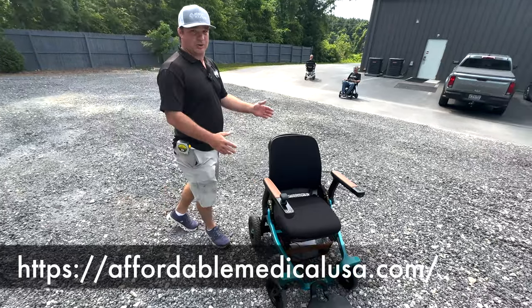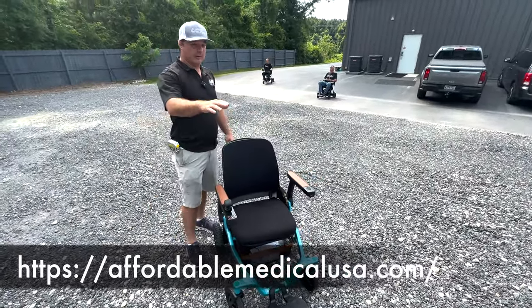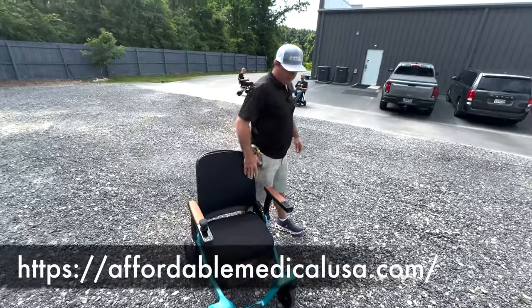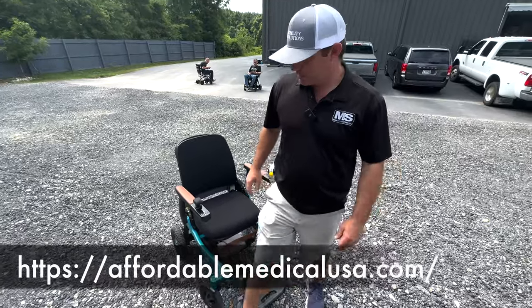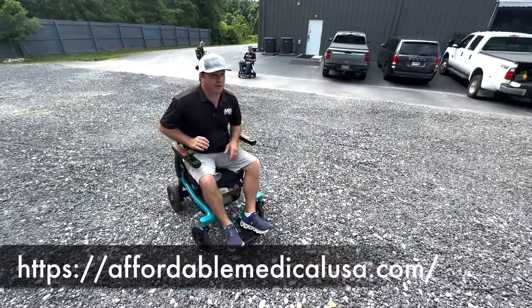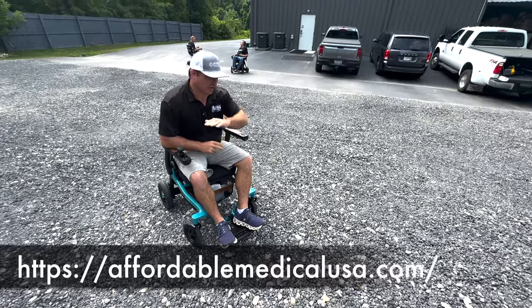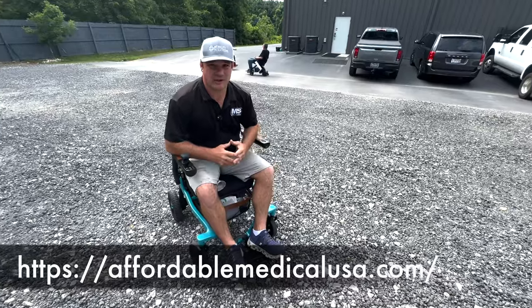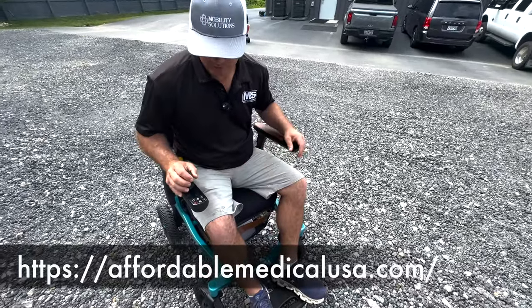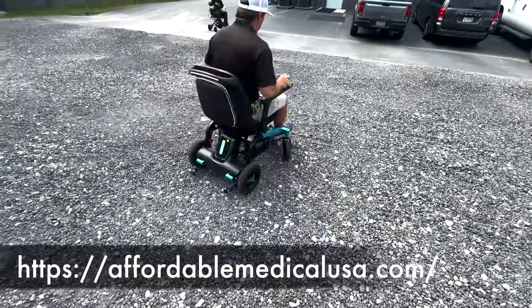This thing could go on the hard surface beach if the tide's down, but getting out to the beach, if there's not like a ramp or some way, it's not going to work. So be careful with falling for some of those videos and tricks to sell you on a beach chair. I wouldn't say buy this for the beach. If you go to the beach once a year and you're taking your mother, your father, and you can get it down to the hard beach sand, I don't see why this wouldn't work down there. You know, the salt's going to crush everything though. So just be careful. All right, let's go do a conclusion really quick.